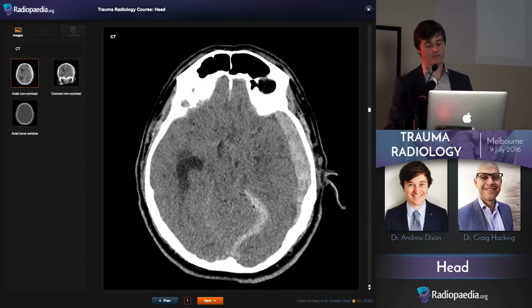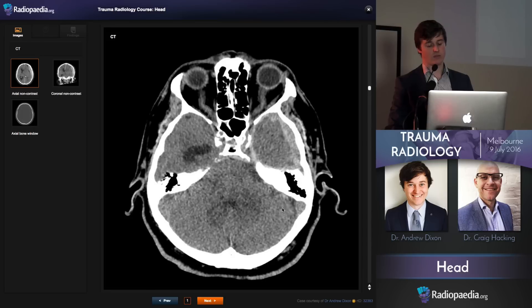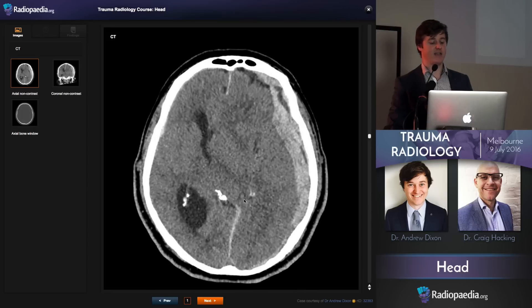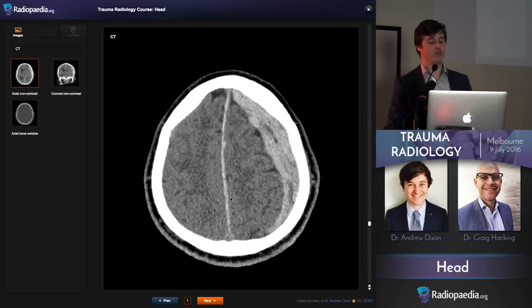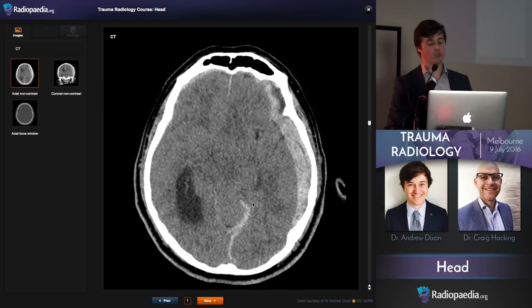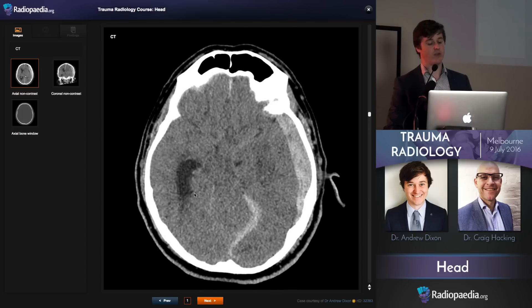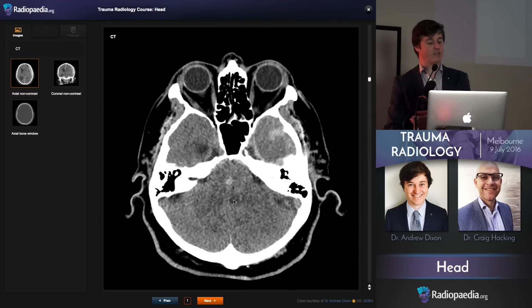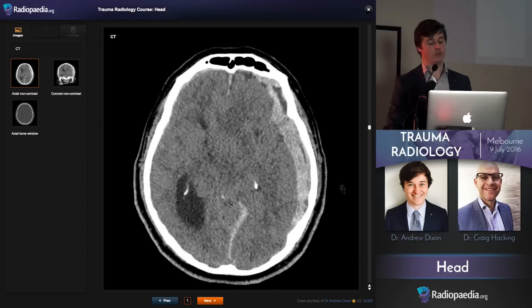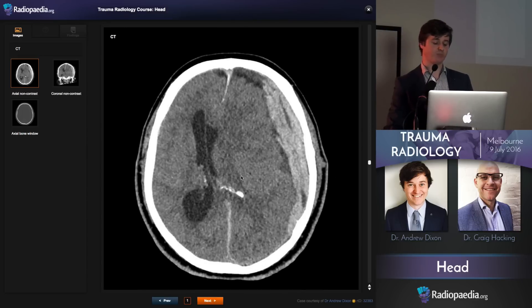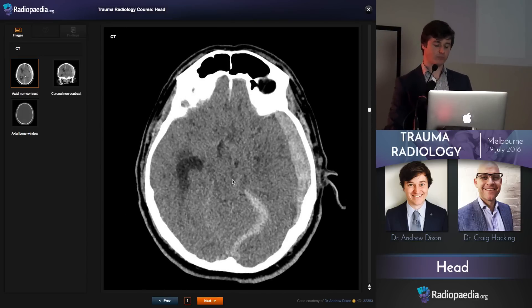Look at that — see that thickening? It continues over the left tentorial leaflet. Often you have isolated hemorrhage just on the falx or just on the tentorium, so you want to look and concentrate on those slices. That hyperdensity moving off to the left or right — that's a tentorial subdural hematoma.